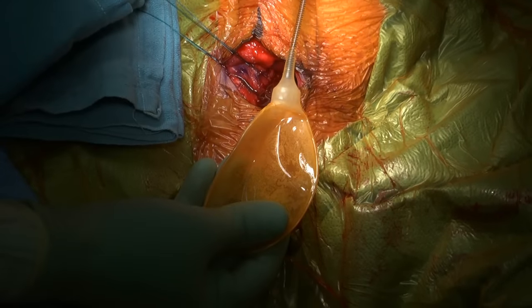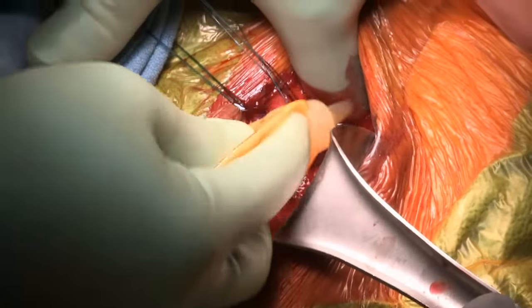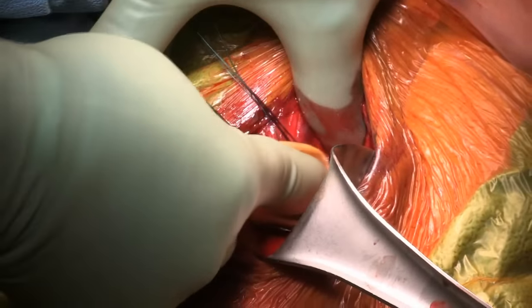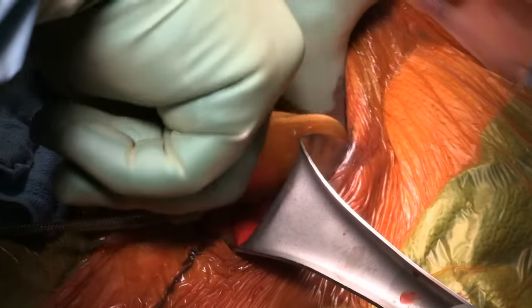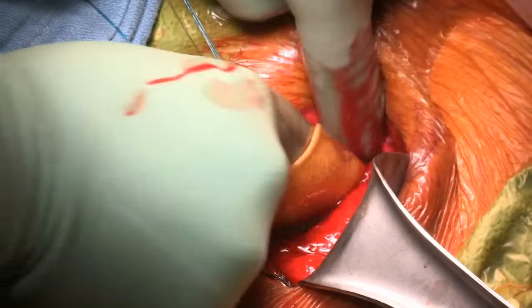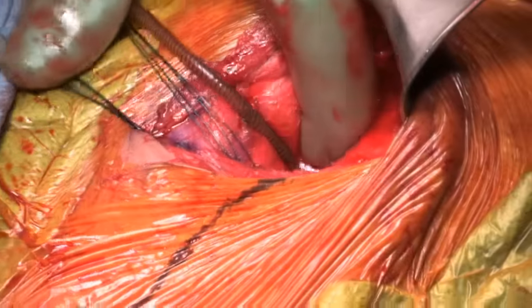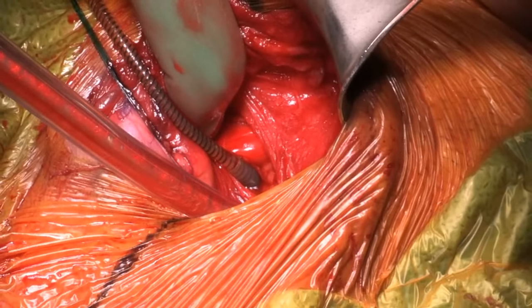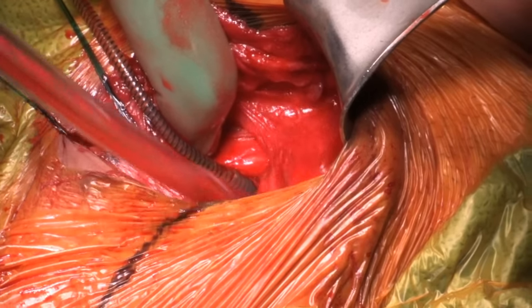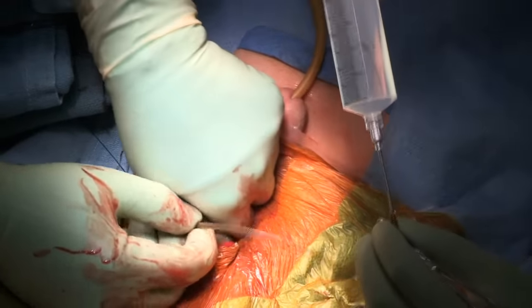I've chosen to place a 100 mL conceal reservoir. I prefer to place the reservoir by leading with the cone end, then use a finger over finger motion to assure smooth placement. The reservoir is withdrawn just slightly and we can see the cone tip emerging from the pre-vesicle space. This will assure easy removal if that ever becomes necessary. We will then fill the reservoir with an adequate amount of fluid for the size prosthesis that we have chosen.